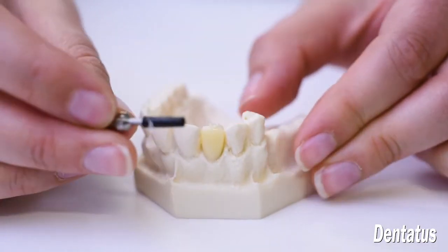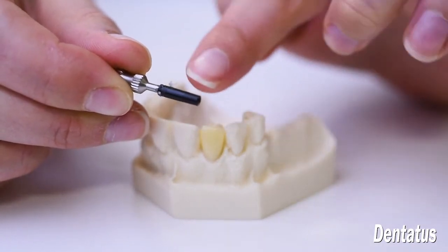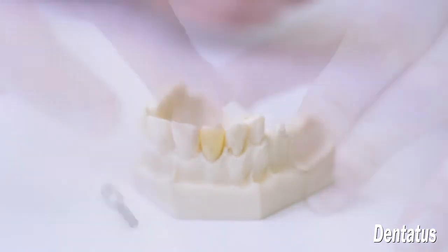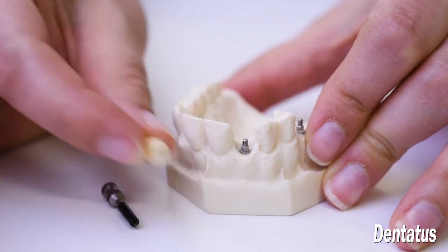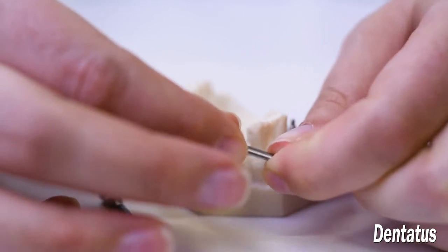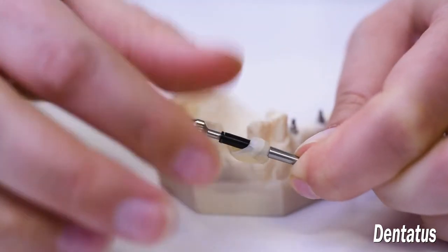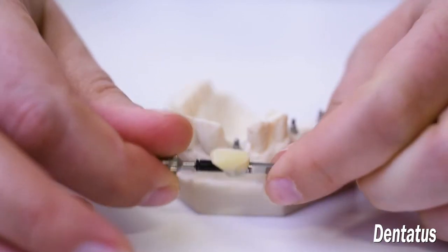Since it's made out of Delrin, the screw cap itself is non-hygroscopic, so nothing adheres to the material itself. You'll see that the component was picked up into the crown. You can use an analog as a handle and reattach it with the screw cap to finish, polish, and fill in any voids.